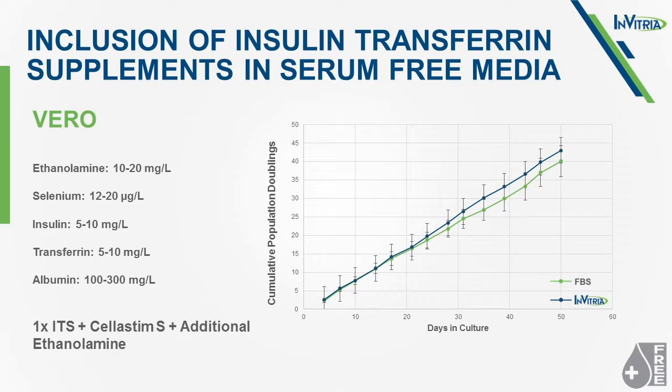And so in an academic setting, at least in serum for virus production, what people do is typically grow these cells in 10% FBS, and then during the virus production phase actually remove the FBS and make the virus in either a basal serum-free media, or they lower the serum to 1 to 2%.